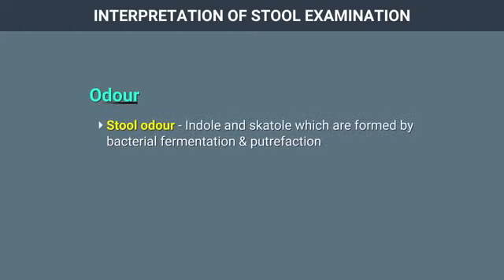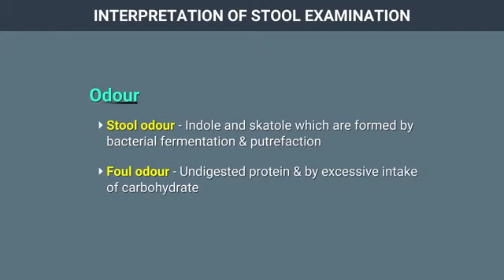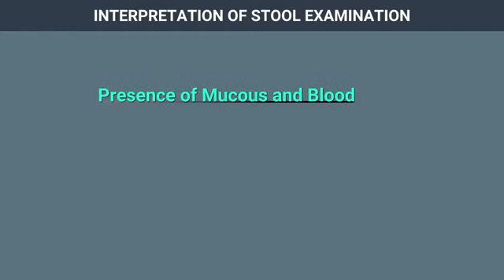Odor. Stool odor is caused by indole and skatole, which are formed by the bacterial fermentation and putrefaction. Foul odor is caused by the undigested protein and excessive intake of carbohydrate. A sickly odor is produced by undigested lactose and fatty acids. Presence of mucus and blood.